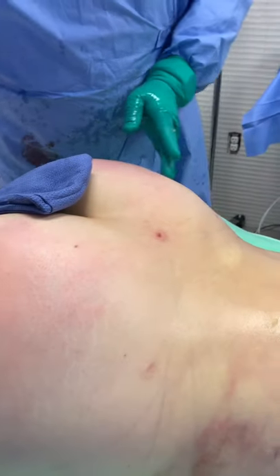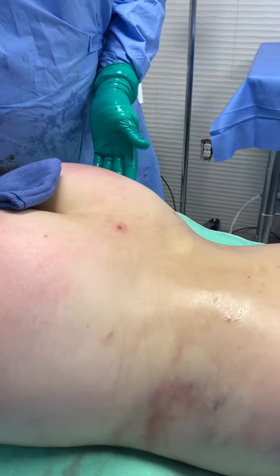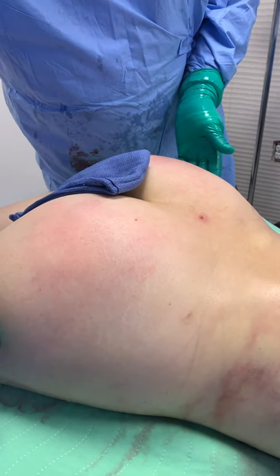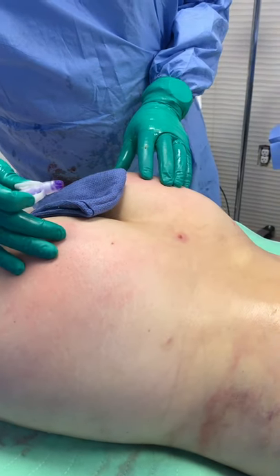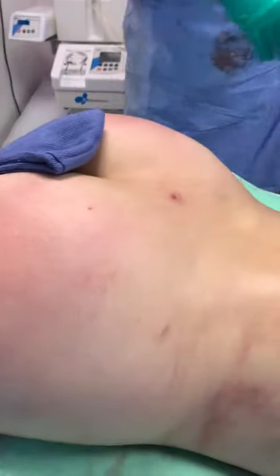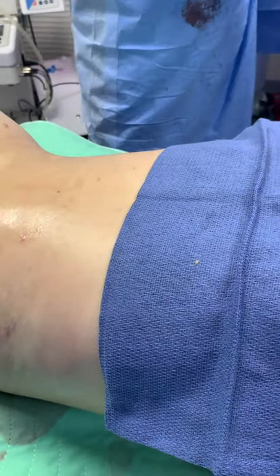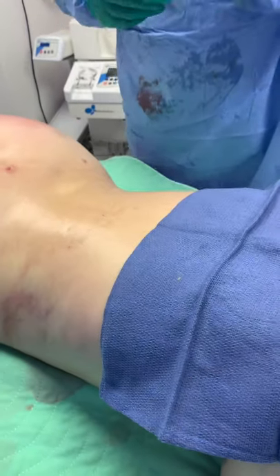We gave her lots of projection. She has a beautiful shape here. One of the few girls that doesn't actually have hip dips. So all we had to do was give her projection, and you can see the outcome is pretty incredible, I must say. So let me suture this one here. And then we are done.